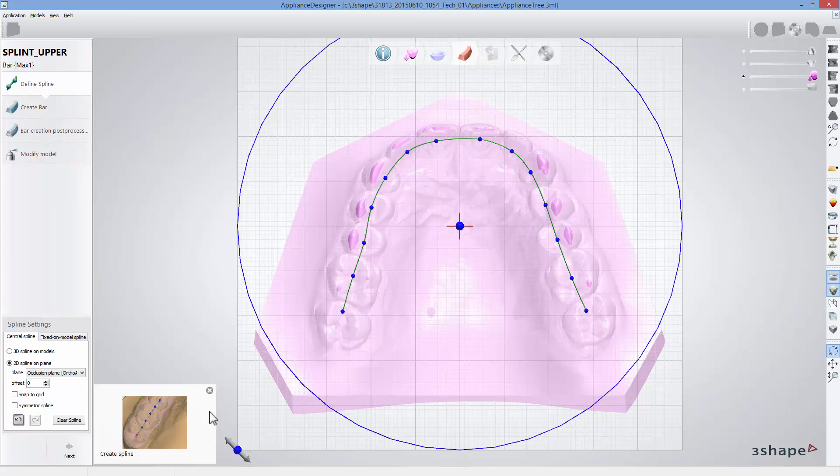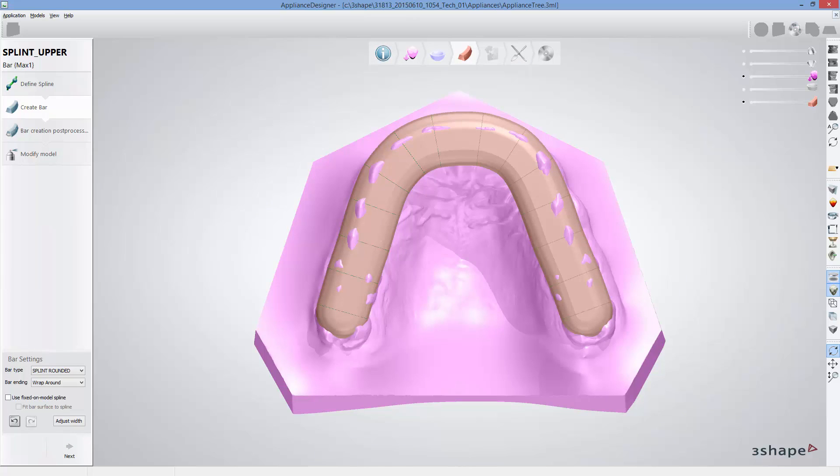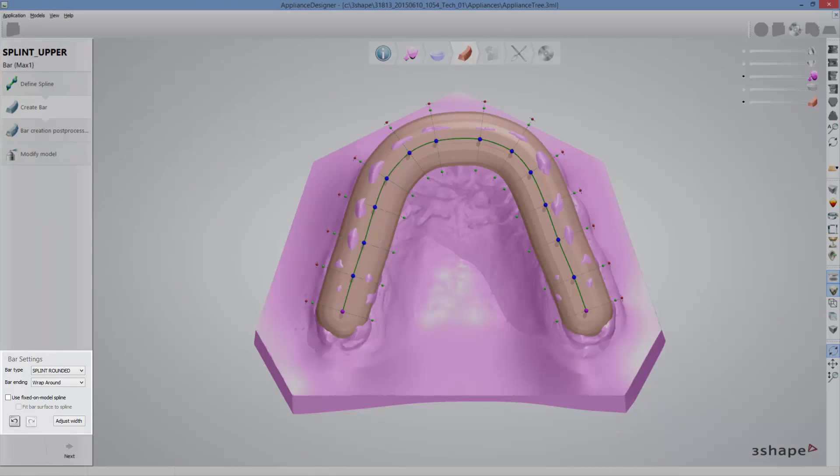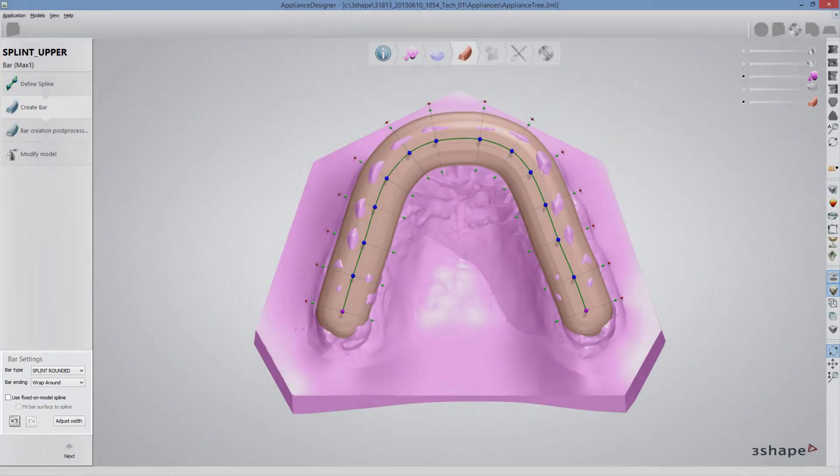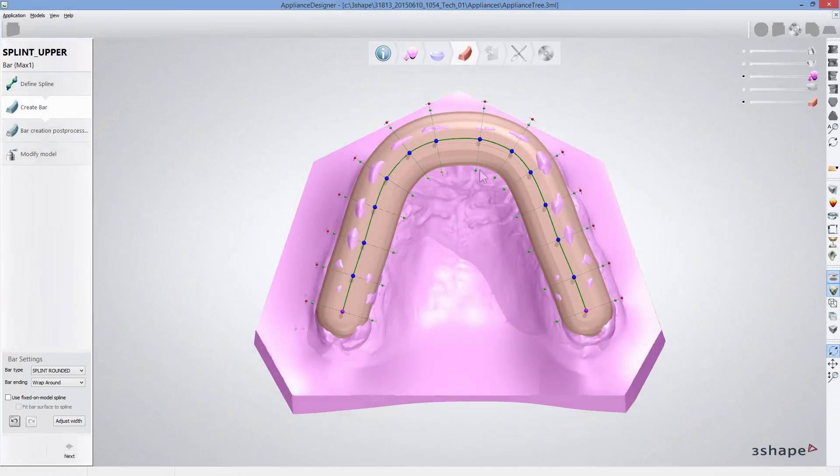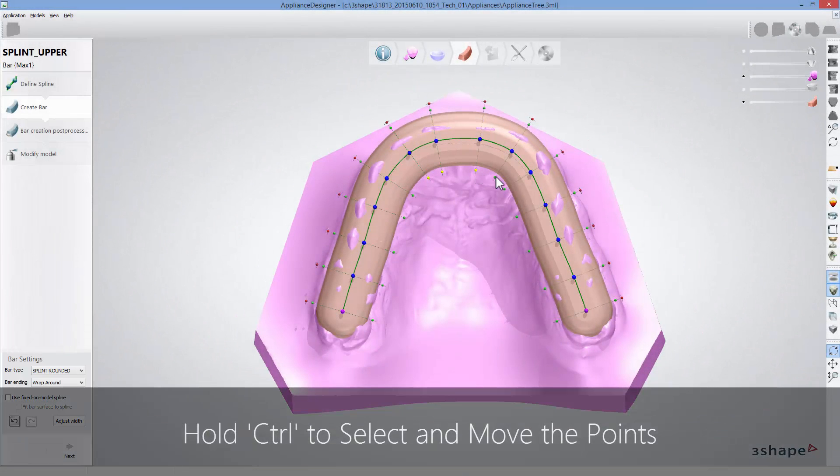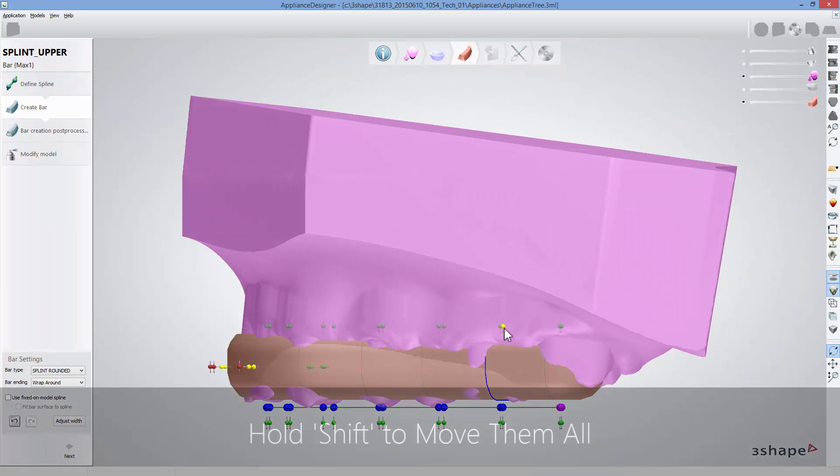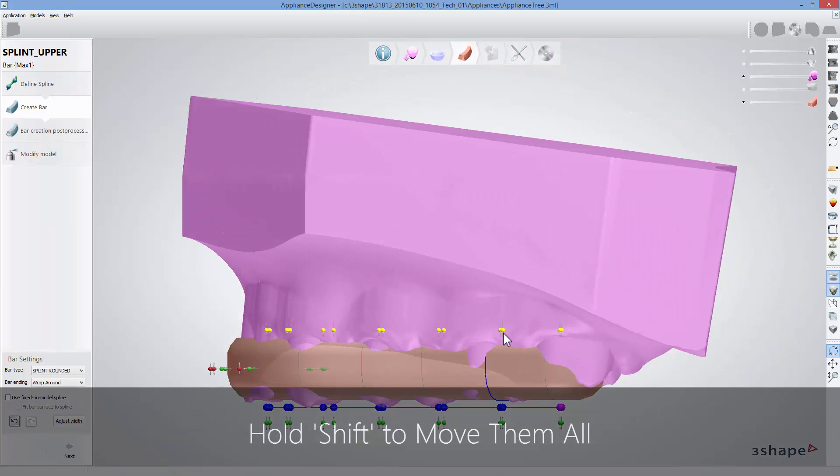When done, click next. Bar has been generated. In the bar settings menu you can change the bar type and ending. To modify the bar design, use available control points to adjust its shape and size.